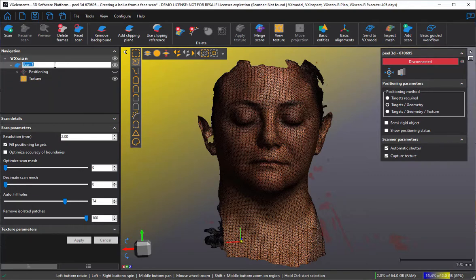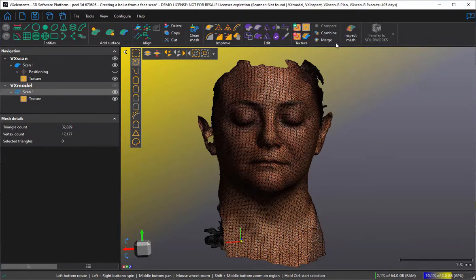I'm going to first send that scan to my modeling software, VX Model, and we're going to work on the scan mesh. We're going to work on the mesh and leave the original scan alone, and I'm going to call it bolus mesh.